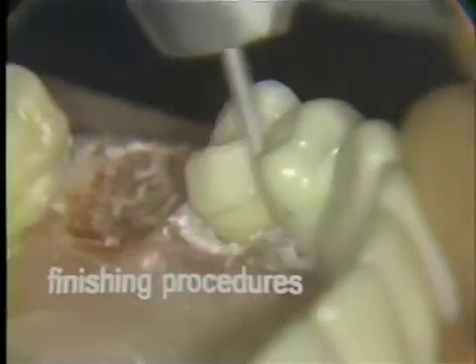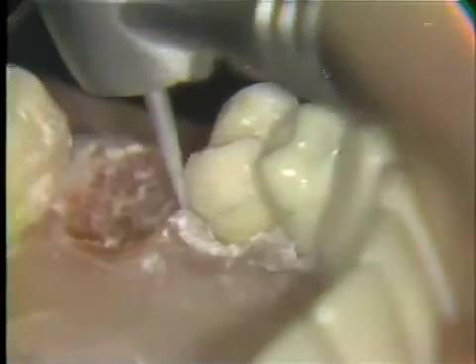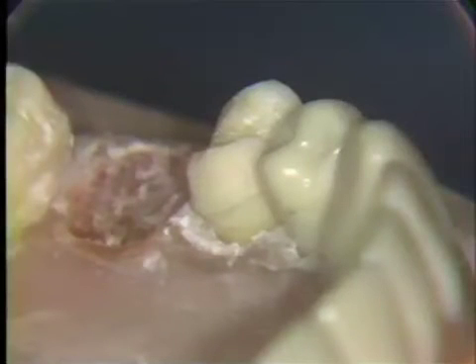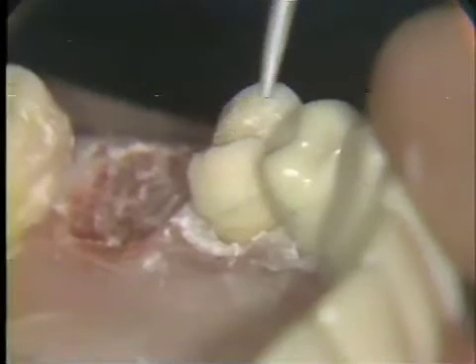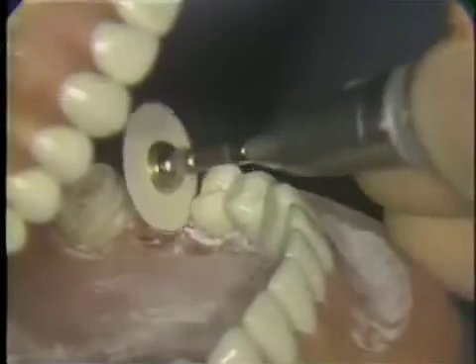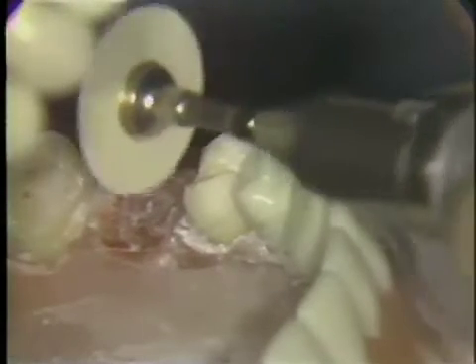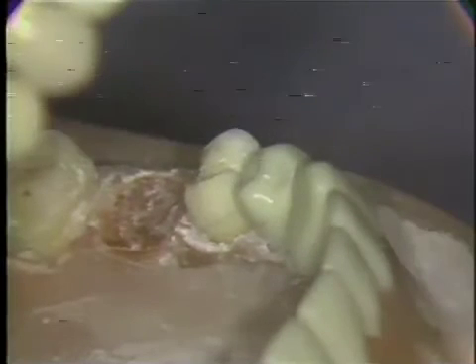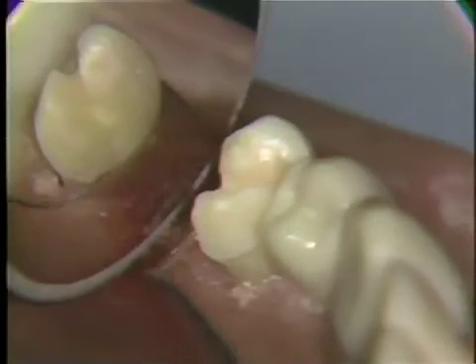The preparation is finished with a fine grit diamond to remove the roughness of the original cutting diamond, and the line angles are rounded and polished. A medium sand disc is then used to remove any remaining roughness in the preparation, taking care not to obliterate the finish lines established with the finishing diamond. The sand disc is turned around on the mandrel and the mesial surface is carefully polished.